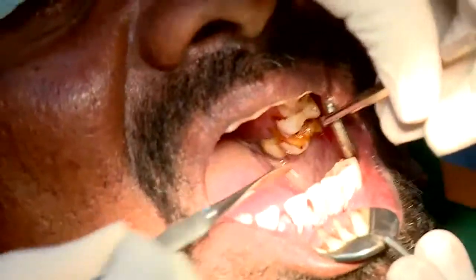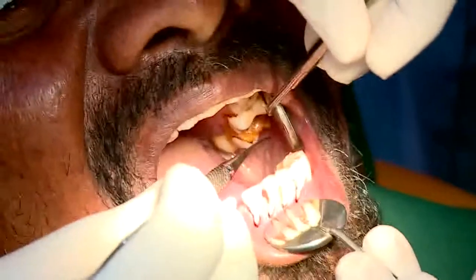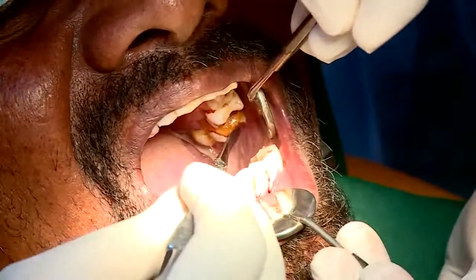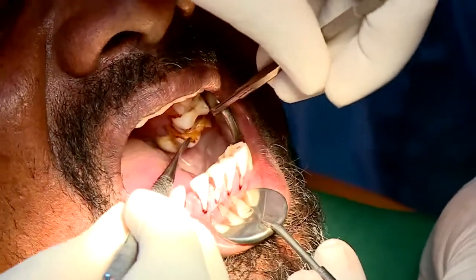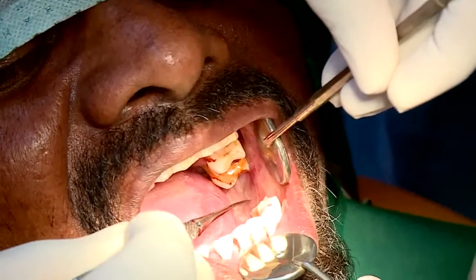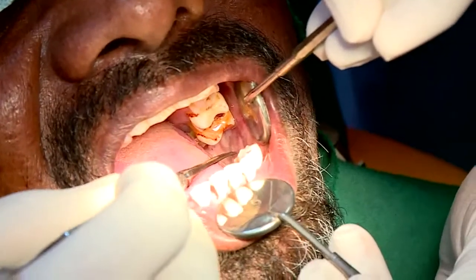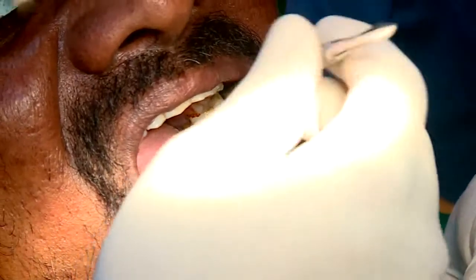Yeah, but this patient must have it a little higher up in the vestibule because his mouth opening is restricted. I'm not able to have a look at the papilla here, and it's in close approximation to the buccal surface of the molars. So splitting the mucosa away from the molar is very difficult over here. What I could see is that it is the midpoint between the two occlusal surfaces of the molars. So this area is not where the parotid duct can open up. The parotid papilla must be somewhere in this area.